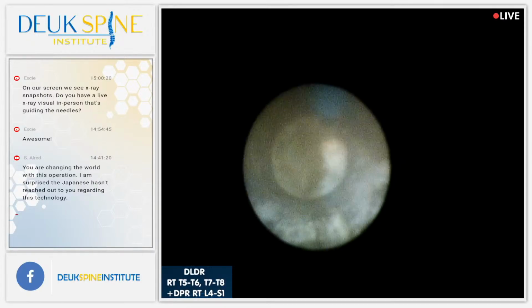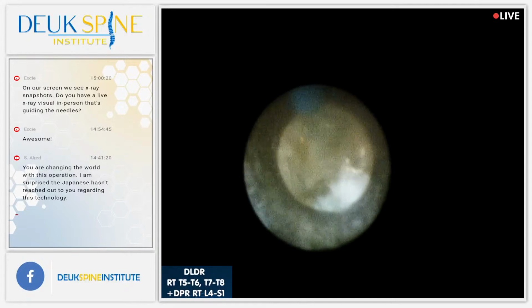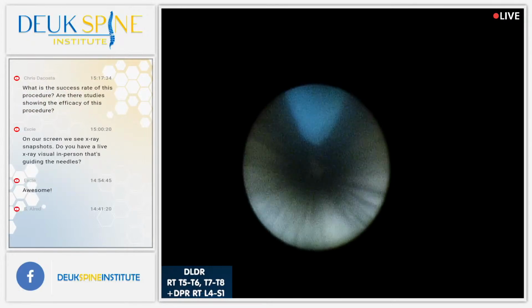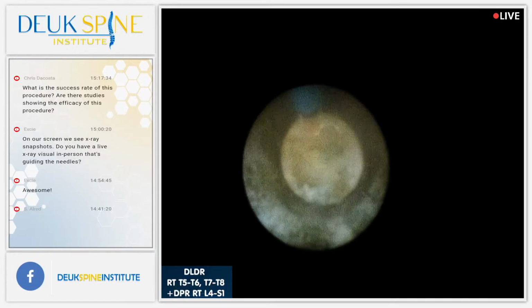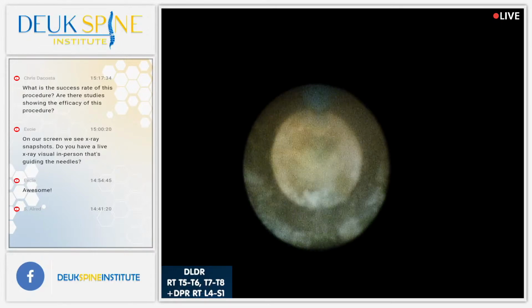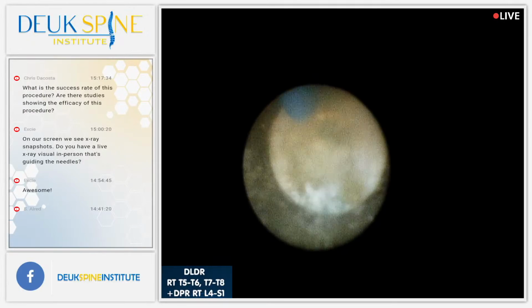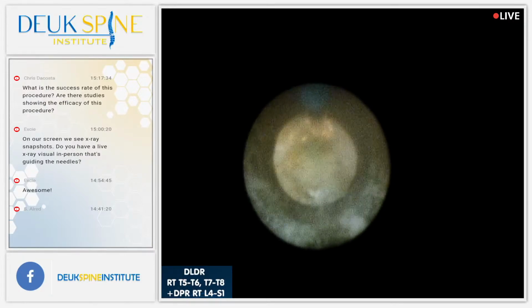Think about if you're navigating in a car or boat. You don't need to continuously think, am I in the right place? Constantly, right? You just use waypoints, like a certain corner, a certain building, a landmark, and you know you're in the right spot, and that's what we as surgeons use. It's pretty common for surgeons to use snapshots on the X-ray as waypoints to confirm where they're going. You take those pictures when you're near sensitive structures to make sure you're not in the wrong place.